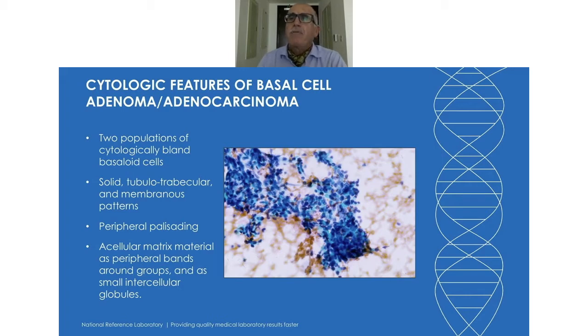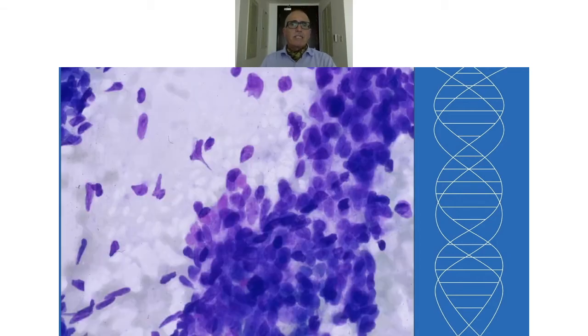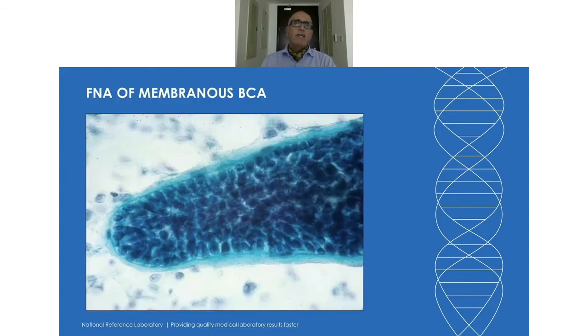We had 23 answers, and they are pretty wildly spread out. 17% thought it was benign, 26% atypia of uncertain significance, 26% neoplastic or SUMP, 22% suspicion for malignancy, and 9% thought it was malignant. So the spectrum is huge, which confirms that this was an intriguing case. This is the picture at high magnification, pretty monomorphic.